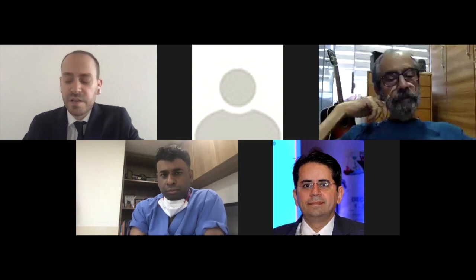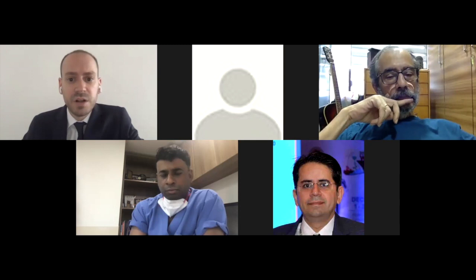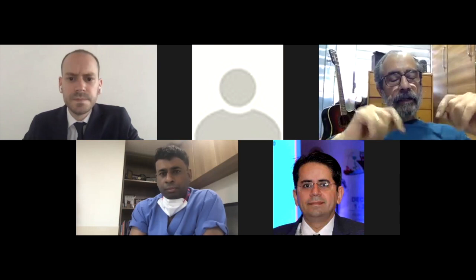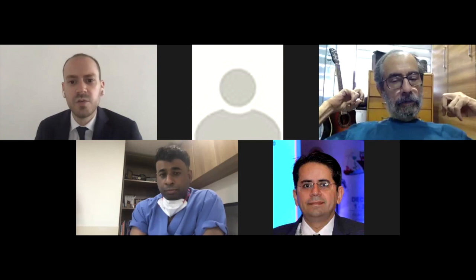It's a problem. So you've used this in how many cases now? Well, I've been planning for a lot of colleagues of mine as well, so we've been using it for more than 100 cases already. Okay. So what I wanted to ask was, when you've planned on the software, do you then also double check it with the alignment rod on the table? Actually, there's a study that you can also do it with the string from the electrocautery.